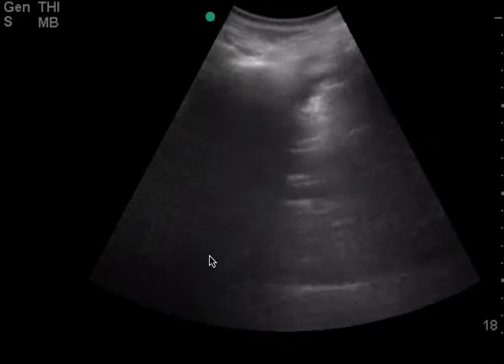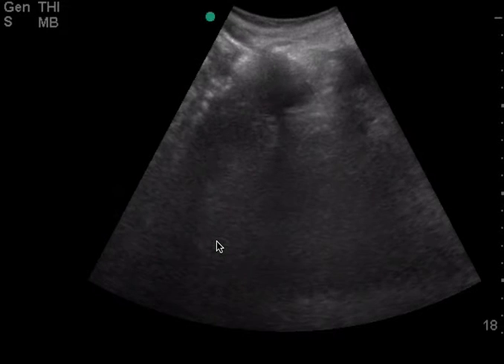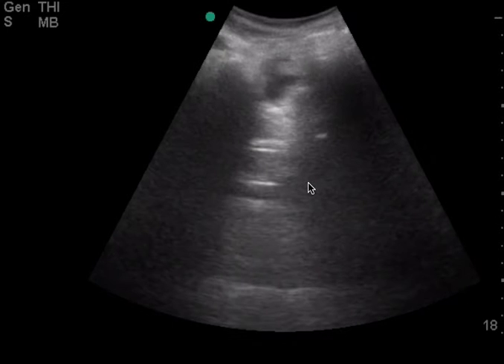This is the pelvis view here on the FAST exam, and I think right there, this is either the bladder, or this is maybe trace or a small amount of free fluid. Hard to tell, but one thing you can realize is that your depth is very, very deep, so there's all this space that's not necessarily necessary — you could decrease your depth.